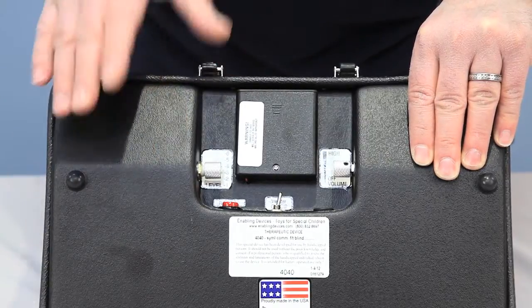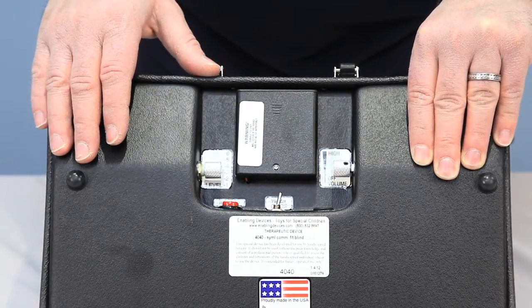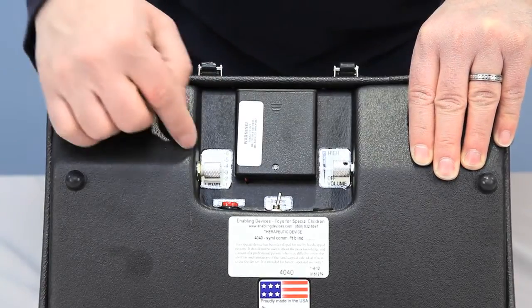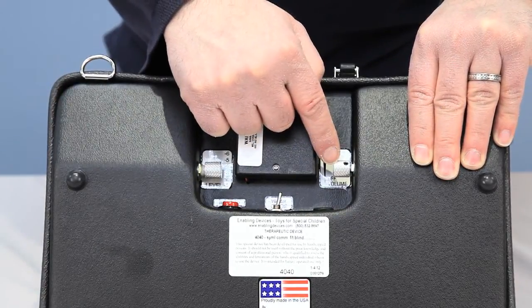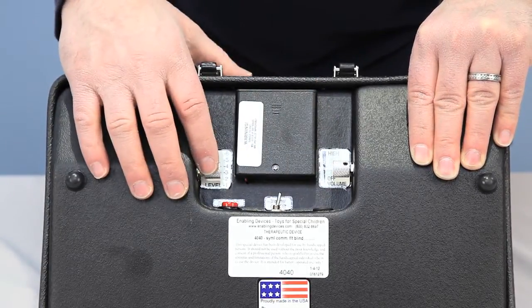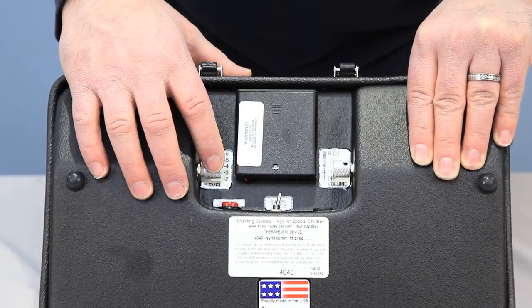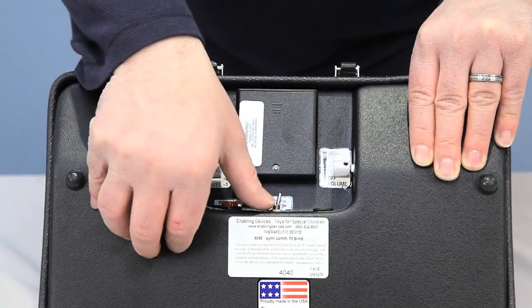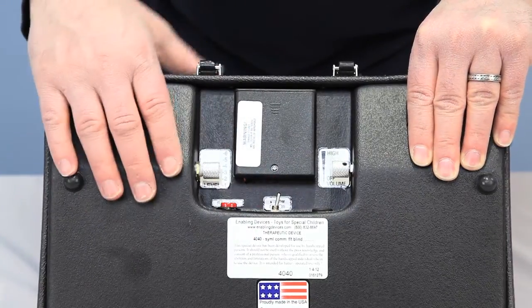Use four double-A alkaline type batteries like Duracell or Energizer. Don't use any heavy-duty or rechargeable types — they don't work for this type of device. You have an on/off volume control, your microphone, a record button, and a level changer dial that allows you to change levels so you can record new sets of messages and retain them.